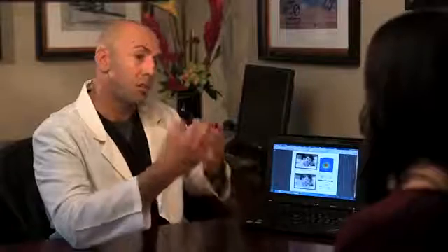Sounds good. Okay. So, the first test we're going to talk about today is something called the AccuTarget HD, and that's the scan that you see here. In this particular scan, we're trying to understand your quality of vision, okay? That's a very important measurement because it's different than what we do in the exam room when we just see, subjectively, can you read 20/20 or 20/30? It tells the doctor, myself, what the quality of your vision is and how you see images.